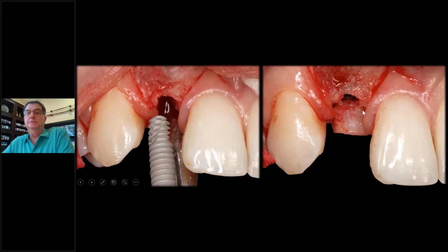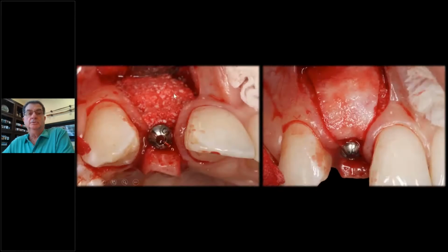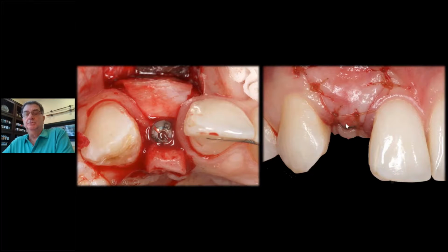Place the implant in. In this case, it's too thin here. We're going to build it up. Went to the palate. I placed the graft in and a membrane over it. Here's the graft. There's the membrane over it, and that's what we do. And now I can pull this over, suture it over, as you see here. Stage 1, stage 2, again, one surgery, one time on this healed ridge.